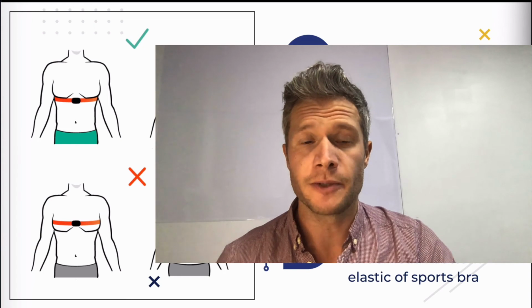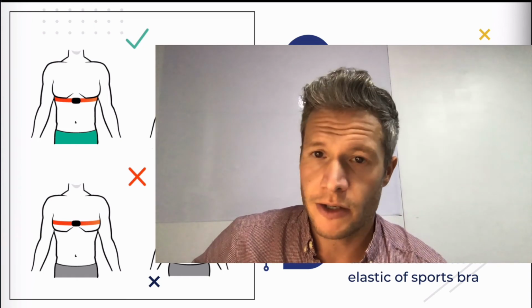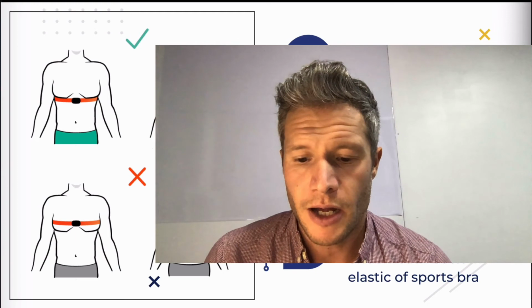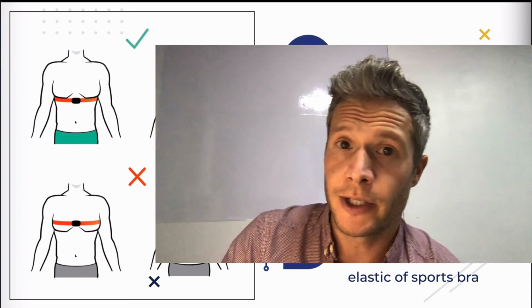So that's typically why the strap is preferred over the watches. Now, are they getting better and better at tracking heart rates? Yeah, they are, and it's good to a point. But ultimately, if you can directly measure something, that's the way you want to go.